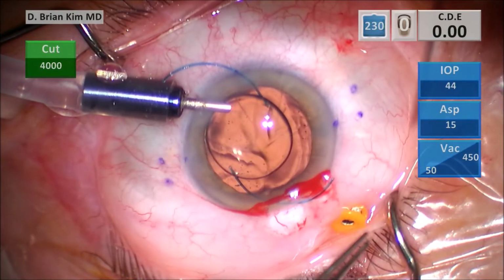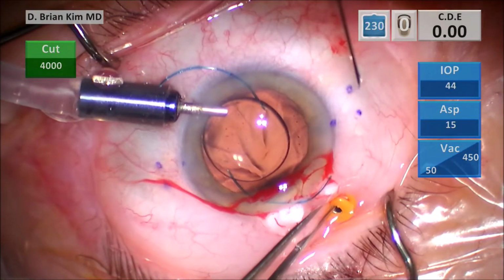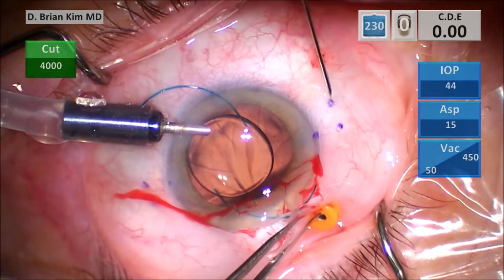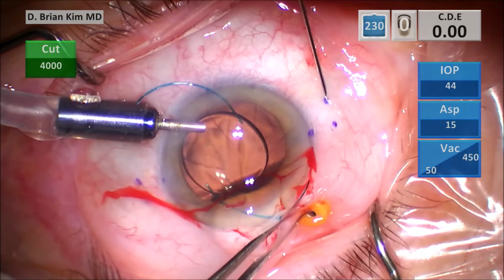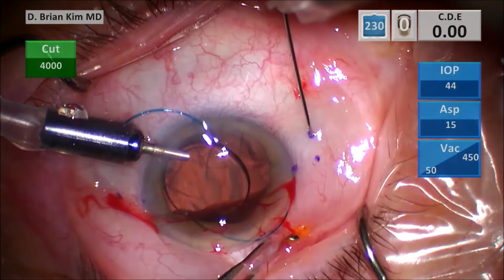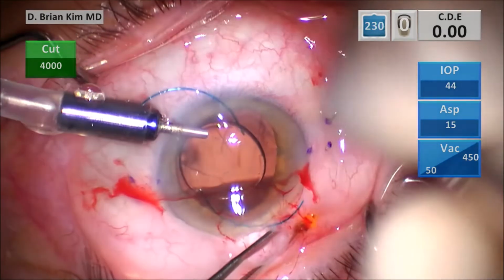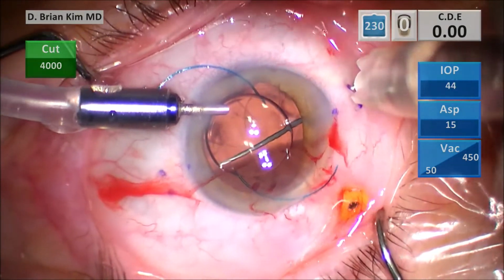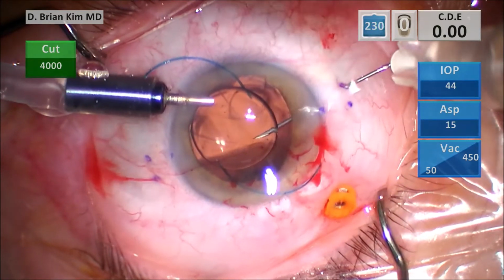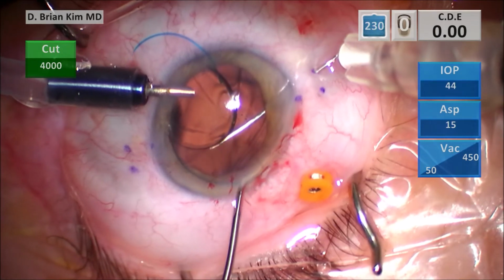And at this point, the AC maintainer is on. The only problem here is you can see there's some ballooning of the conj. That's the only downside, but I feel good about the positions of my ink marks. I feel like that's proper. I have the needle. I'm stabbing at the first mark, tunneling through the sclera, making sure I'm flat, tunneling to the other mark 2 millimeters next to it, and then diving down towards the nerve and then rotating. You don't want to rotate superficially. You might scrape the ciliary body. You want to point towards the nerve and then rotate and lift up.